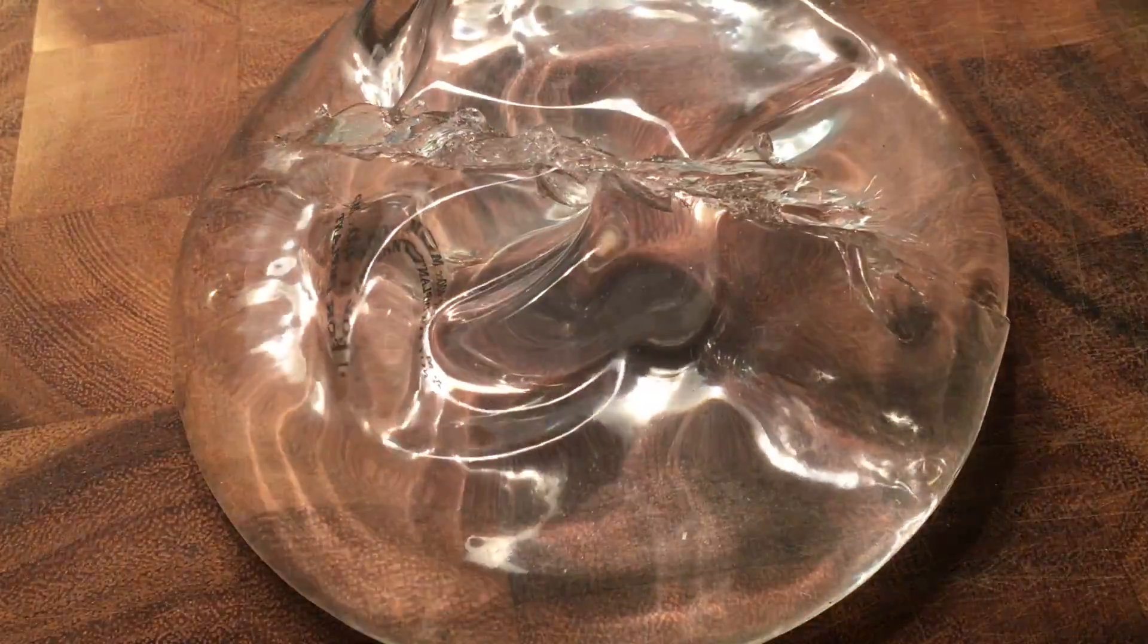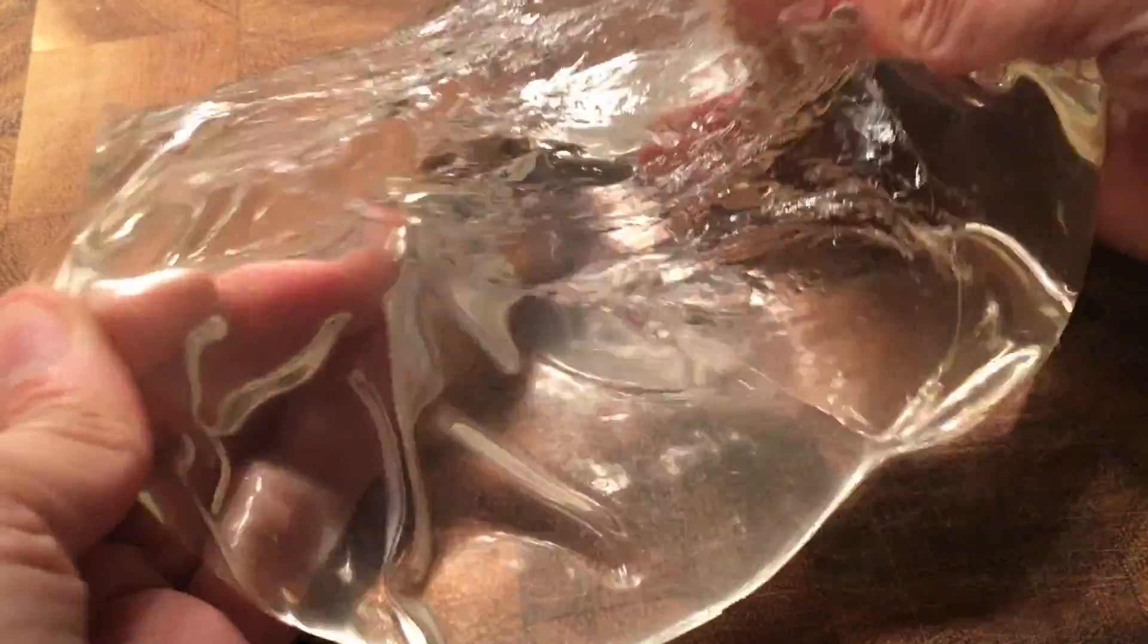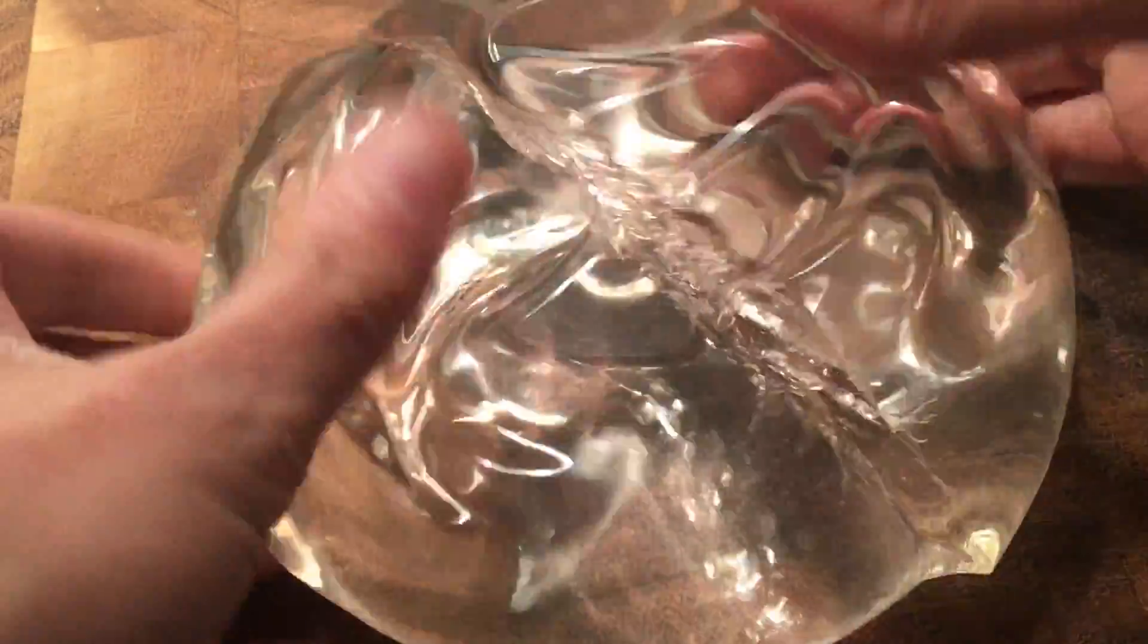Okay, so I've cut open this implant and you can see it doesn't spill out. It's fairly cohesive. It's gooey. It's like a really, really thick jelly. It's not as thick as a gummy bear but it doesn't ooze out all over the table.